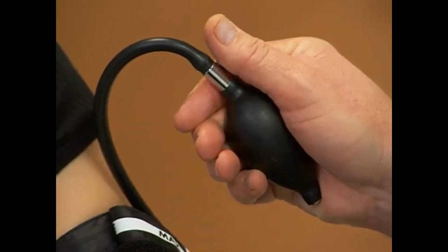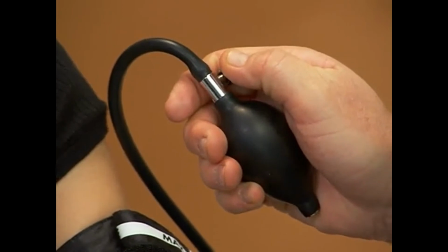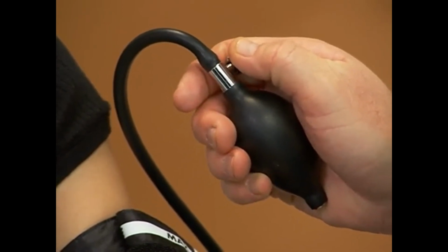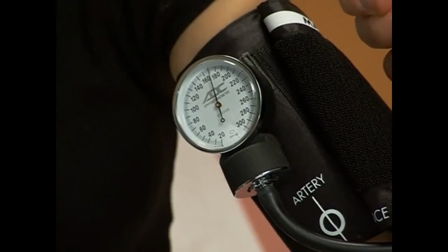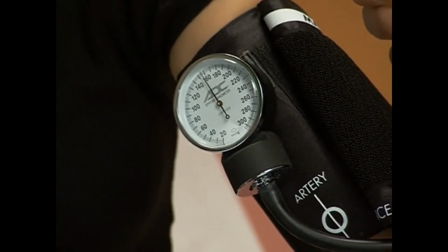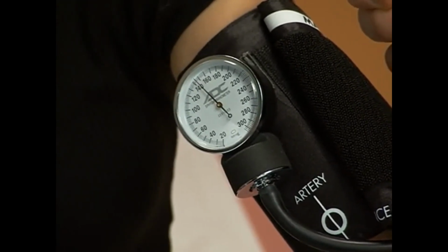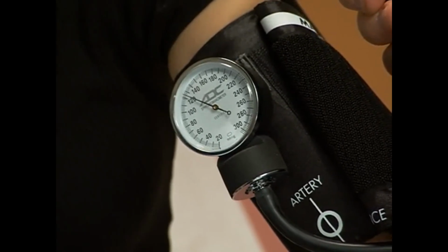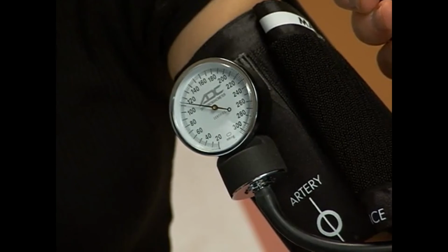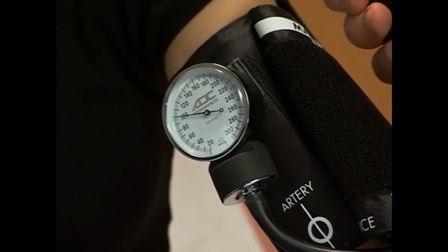Next, while continuing to palpate the artery, open the bulb valve just enough to slowly deflate the cuff. As soon as you again feel a pulse, note the reading on the gauge. This is your estimated systolic BP, also called the palpable systolic pressure. Then quickly deflate the cuff completely.